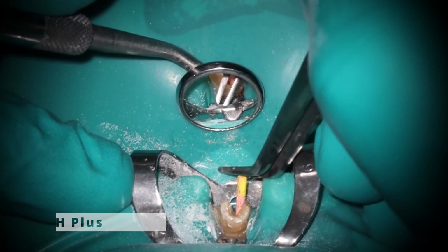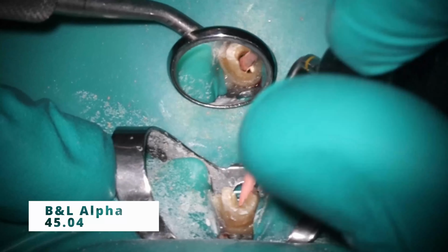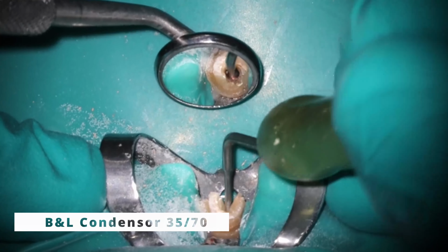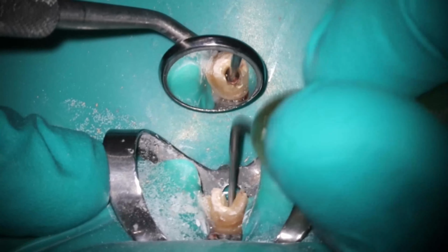Tiny amount of AH Plus, you do not need a lot to seal this off. And when you go in with the Alpha, you don't want to press too hard apically. You actually want to go in and kind of sear laterally. And same thing with the condenser, really light. You just need to sear this off. This is almost a single cone at this point because you don't want to put a ton of force on here. Isopropyl alcohol to clean it out.